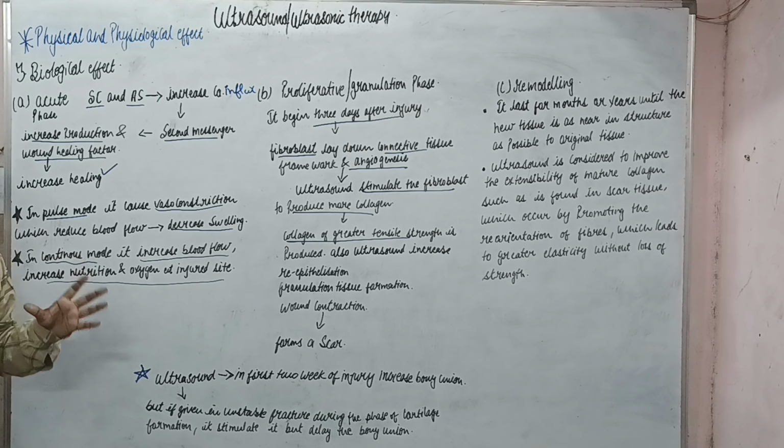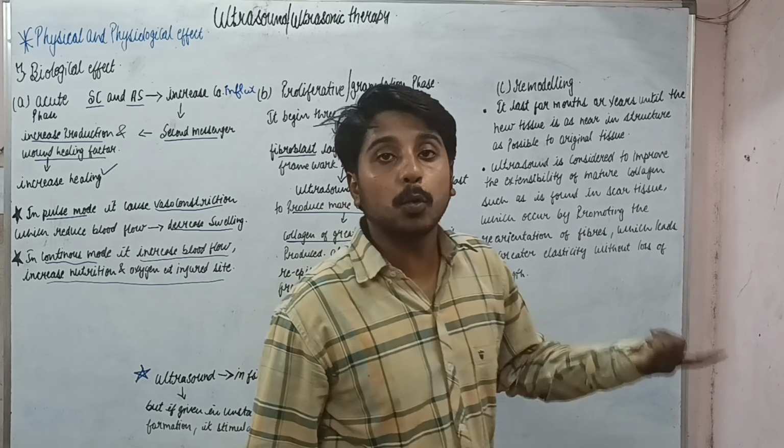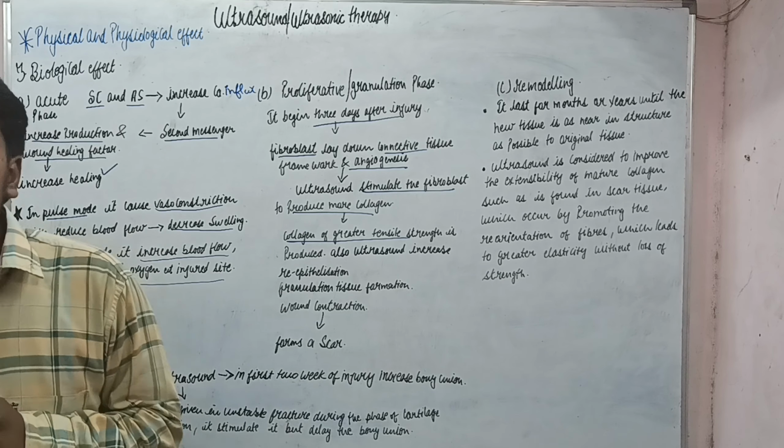Another important point related to bony healing is that if ultrasound is applied in the first 2 weeks, it is good and it increases the bony union.